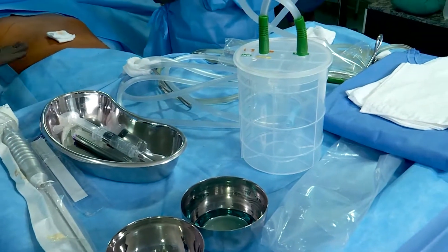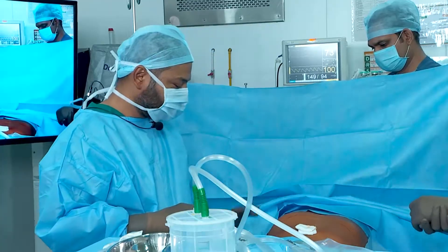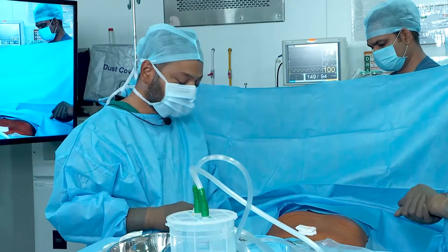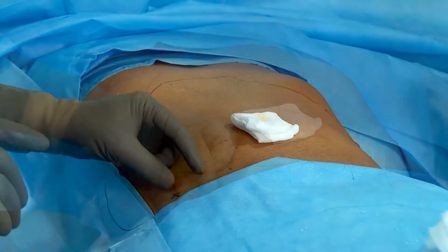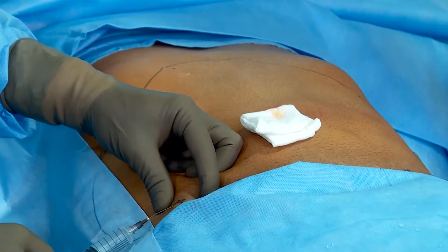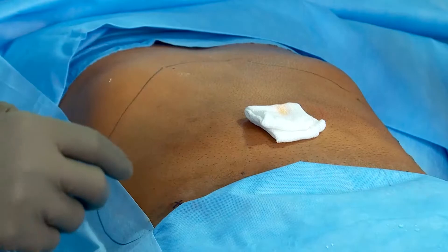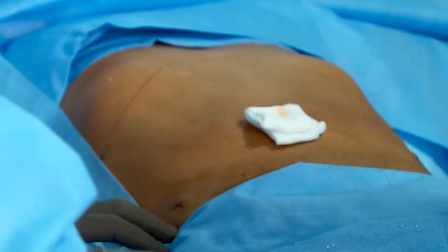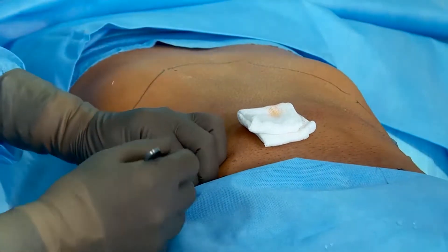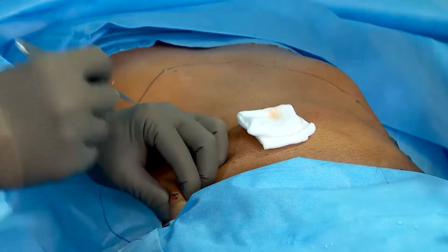On the patient, we initially mark the area where we can harvest a good amount of fat. The marked area is approximately 2 cm above and medial to the anterior superior iliac spine. From this area, we have easy access to the whole of the abdomen.